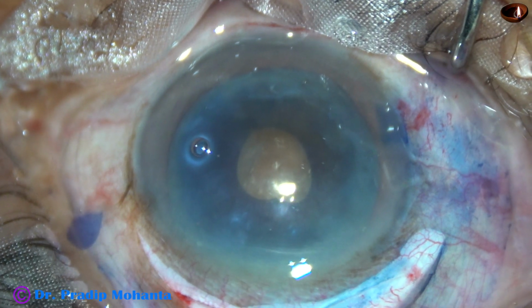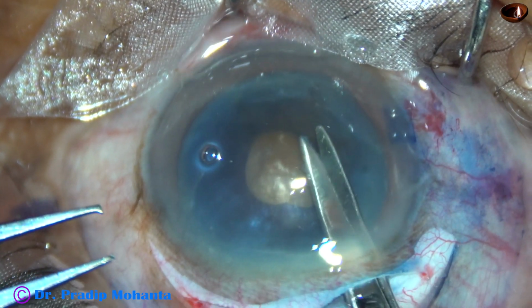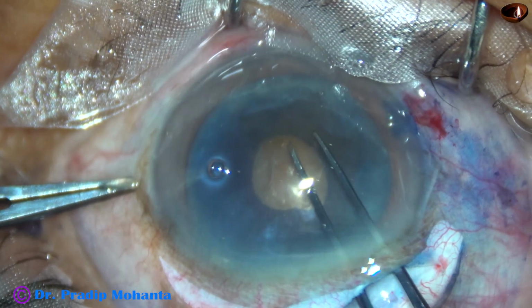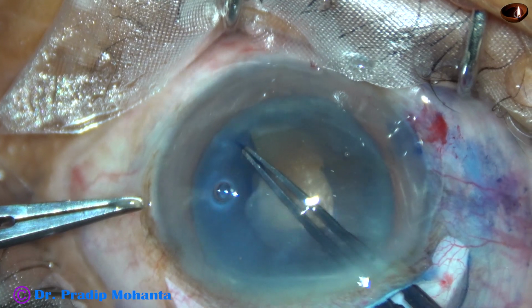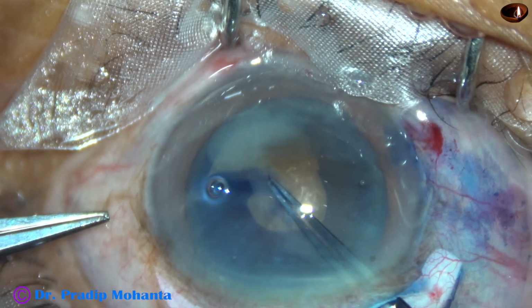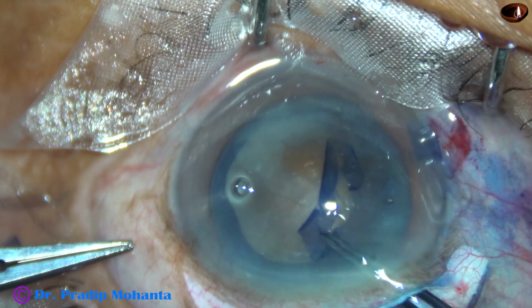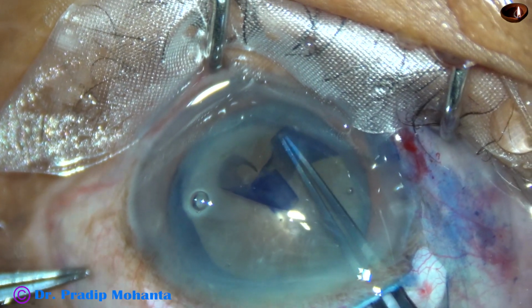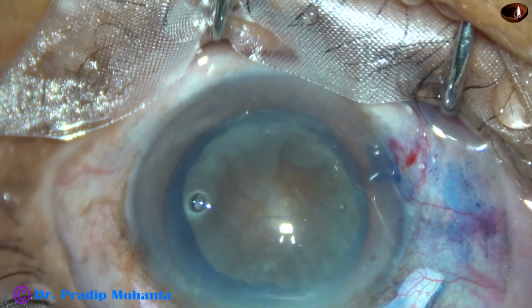And now I take Vannas scissors and make a cut, and now I take the Utrata forceps and do a large rhexis, about 6 mm in size, because I have to prolapse this huge nucleus. The rhexis tends to go to the periphery and I bring it back. So it was a play of balance, and here it is, completion of the large rhexis.